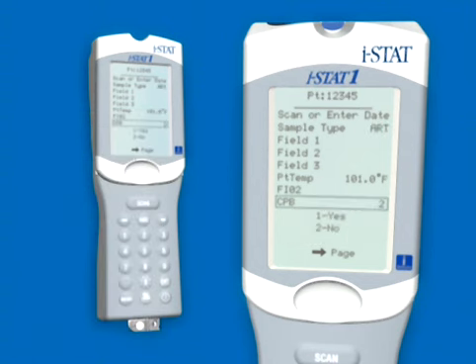For CPB, the choices are 1 yes or 2 no. Default will always be 2 no. CPB is included on the screen only when the cartridge includes a sensor for hematocrit. It is recommended that each practice verify the use of the CPB sample type and the length of time in which the CPB sample type should be used during the recovery period.